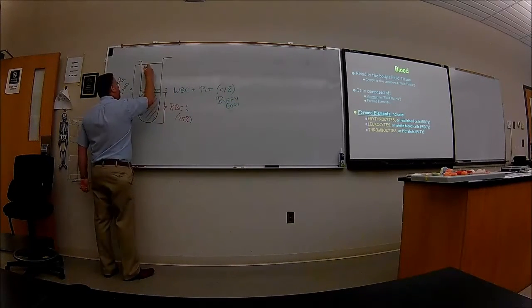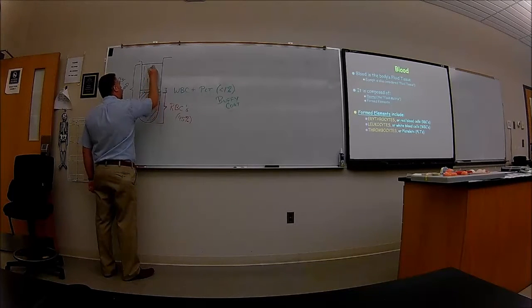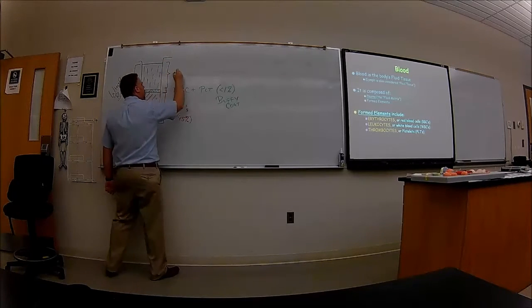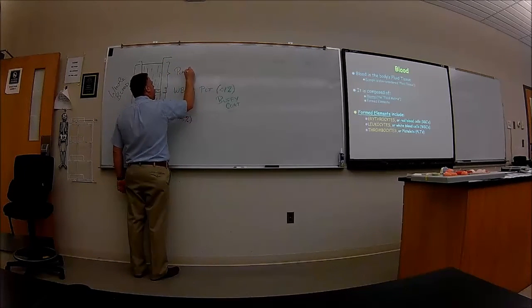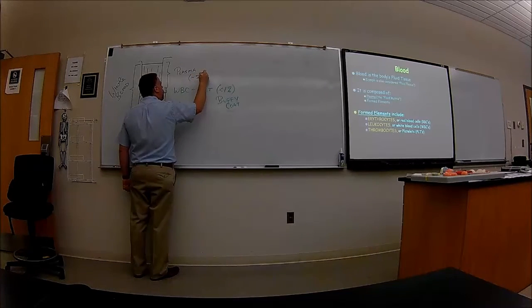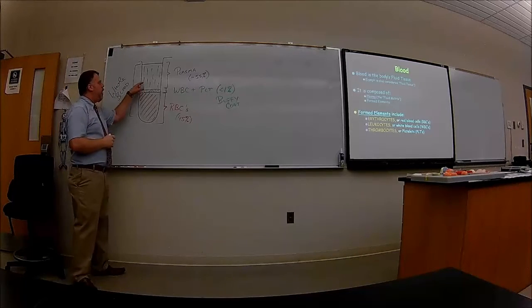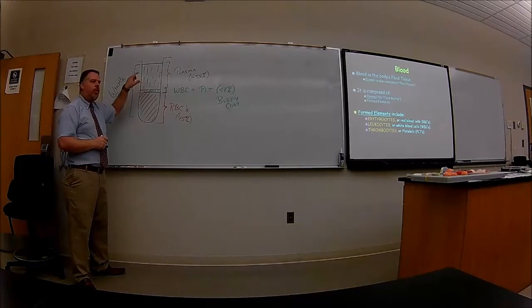In this area here is mostly water. This is the plasma. This is about 55% of your whole blood. And in there, you're going to have all your hormones, all your oxygen gases, your fibrinogen, proteins, everything's in there. Okay?